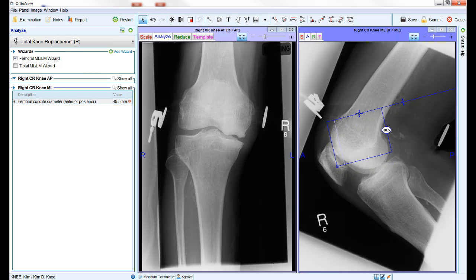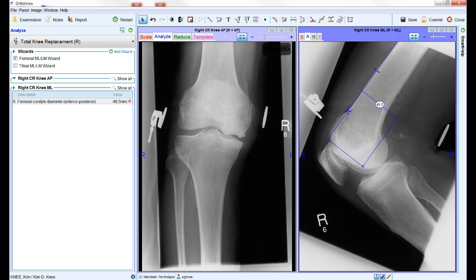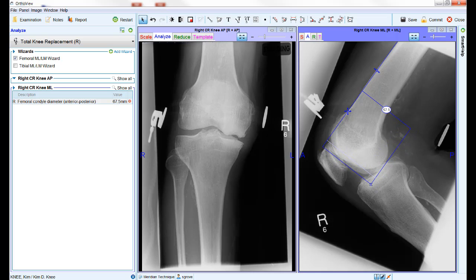For the femoral wizard, start by placing the main control point on the anterior face of the femur at the base of the femur just above the condyles. The second point is used to orientate the wizard so that it aligns with the anterior face of the femur. The third point is used to create a box around the condyles, aligning with the bottom and back edges of the condyles.